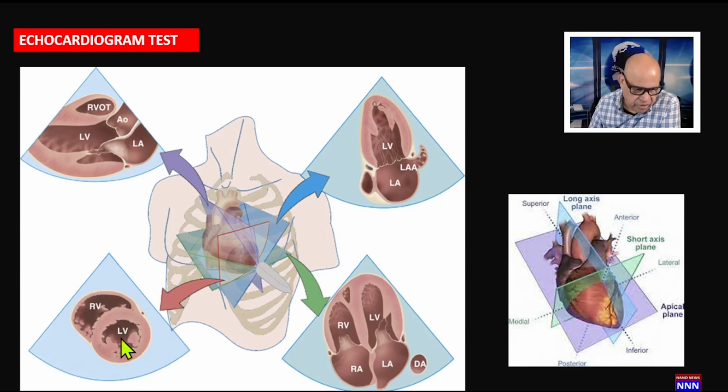If you're going through this way with a parasternal long axis, you're going through the anterior wall and the posterior wall. Whereas with the four-chamber view, you're going through the septum and the lateral wall. These are exceedingly important points to bear in mind because you need to train your brain to have a three-dimensional view of the heart as you would normally see if you open up the chest. But the beauty of the transducer is you can do that without opening up the chest, just with these angulations and variations in the views.